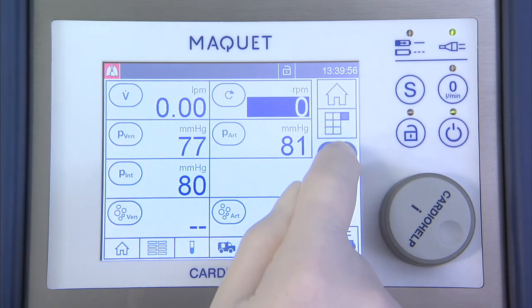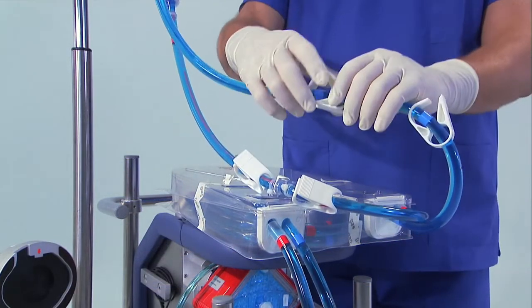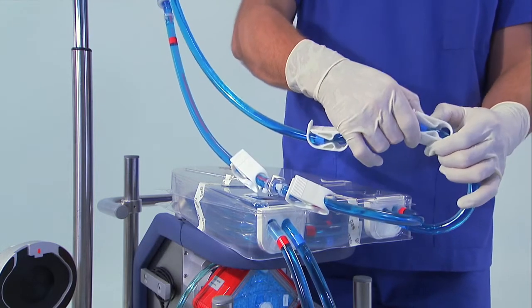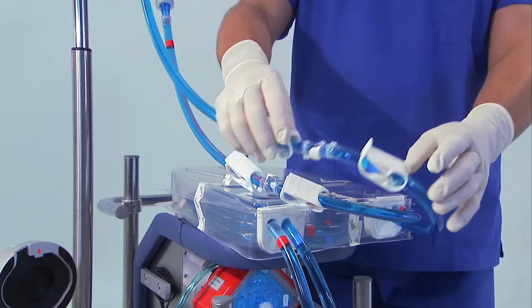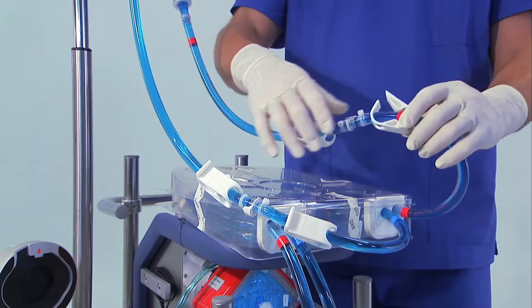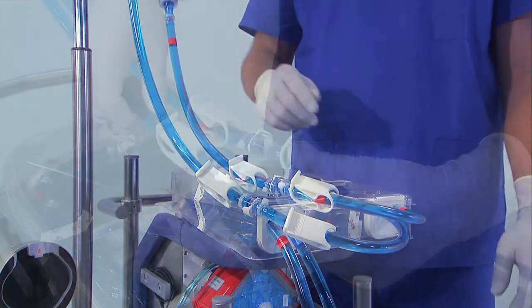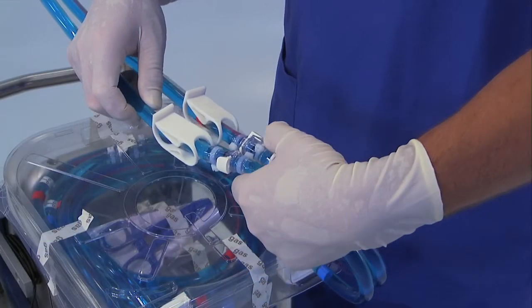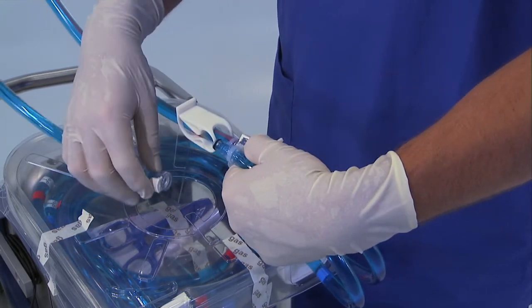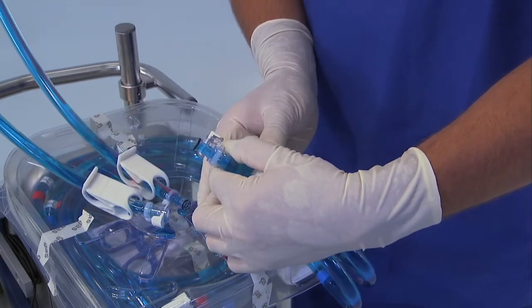De-activate the mode Global Override. Close all clamps on the red and blue lines. Connect red to red lines and blue to blue lines.